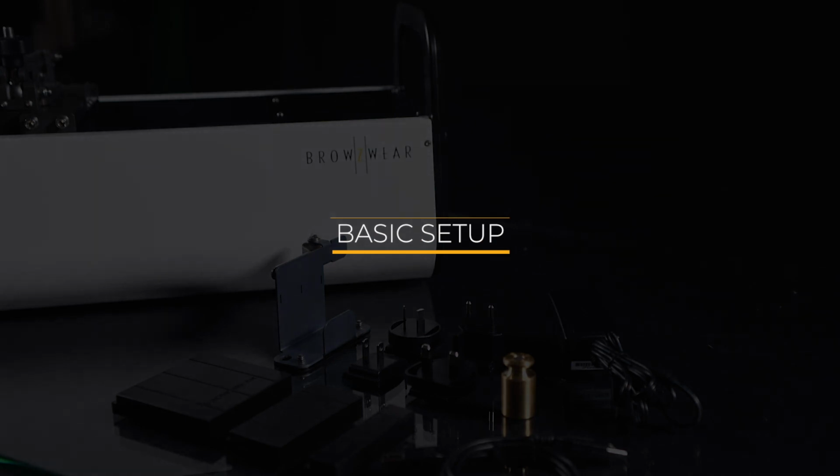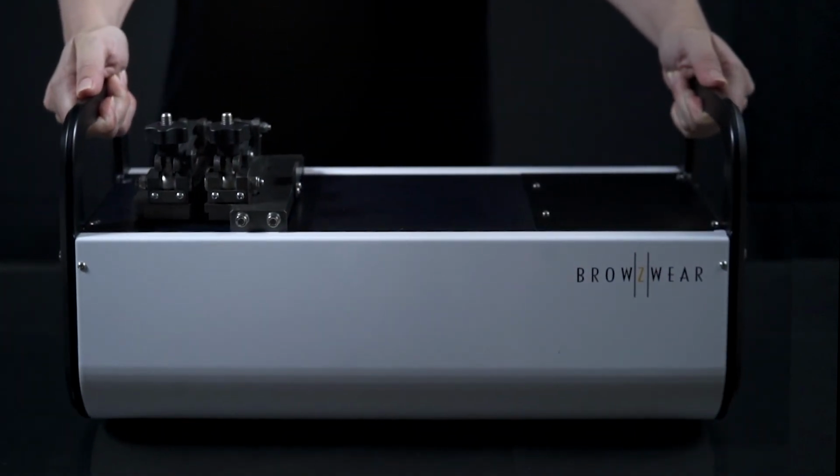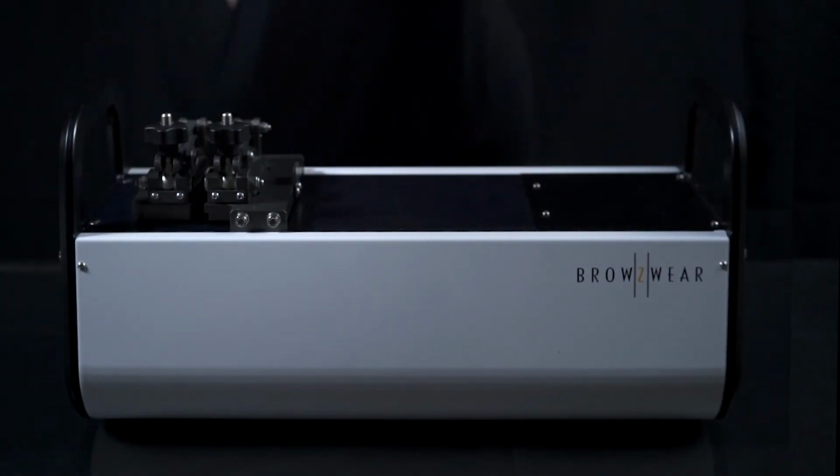You're ready to begin setting up your FAB machine. Ensure your FAB is positioned on a flat, stable surface so the testing sensors do not pick up extraneous movements from the surrounding environments and potentially corrupt your data.